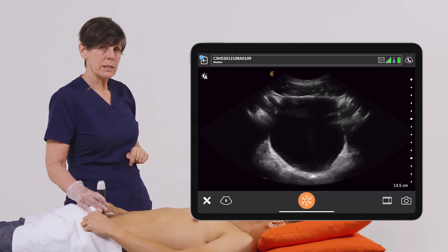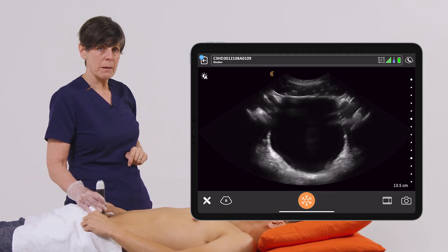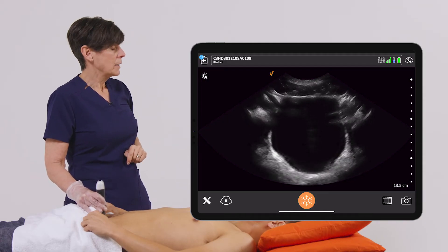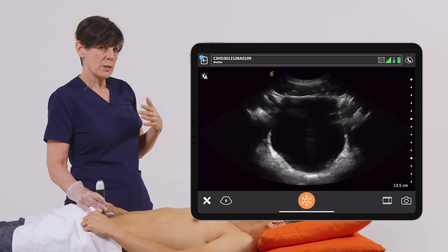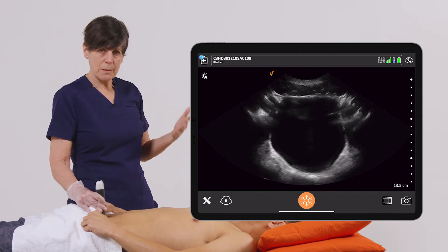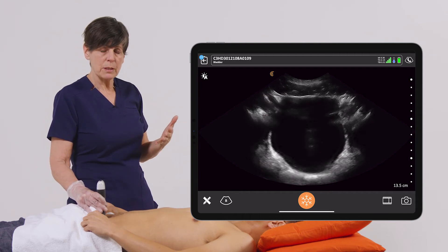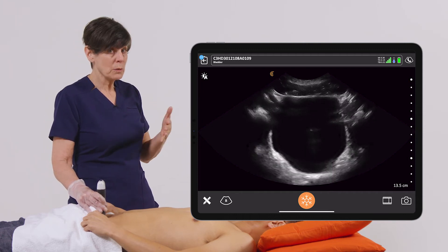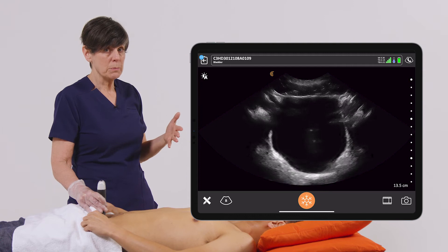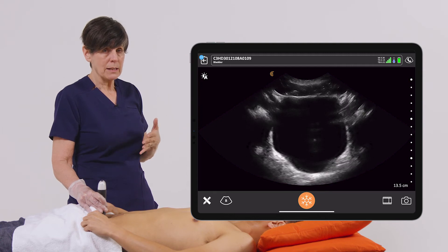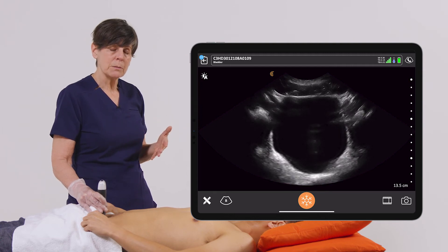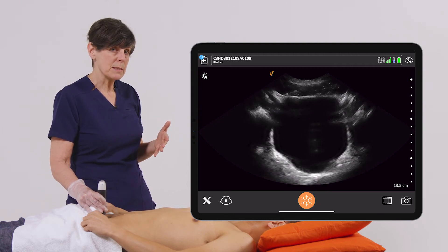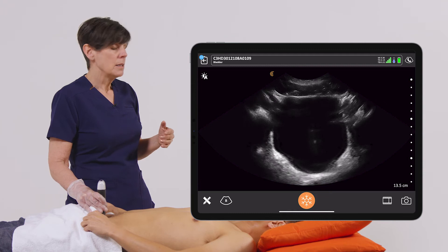The other thing we want to talk about is depth. Clarius has worked hard to make sure that the depth comes up in the appropriate preset in the range of where it should be. But everybody's built a little bit differently, so you may have to make adjustments to this.